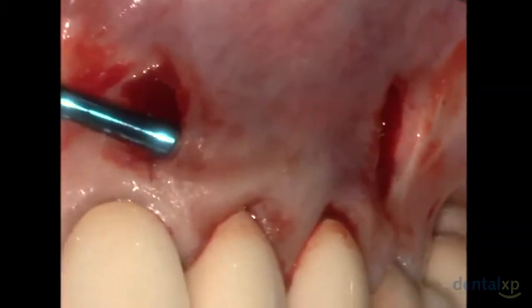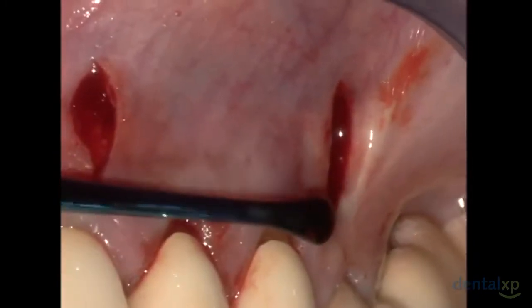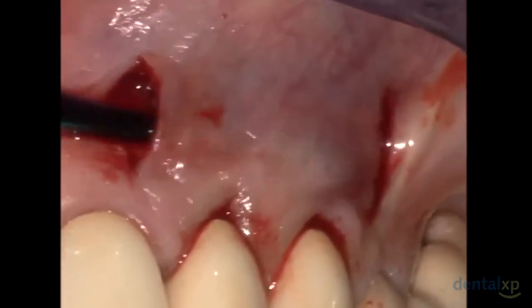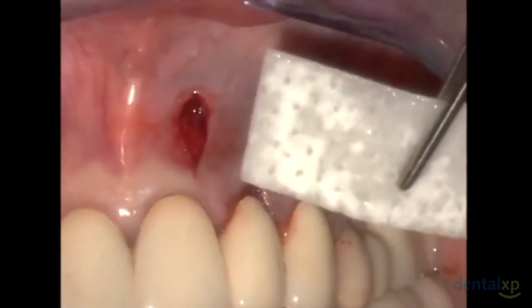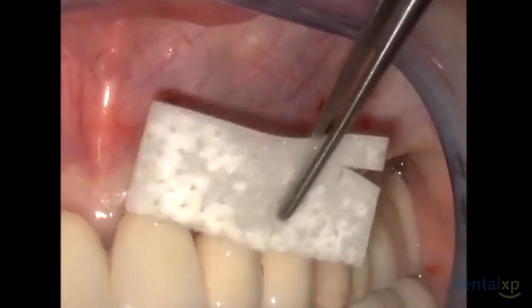We extended it into the interproximal areas, and we're now testing to make sure that we've relieved the flap enough to be able to apply tension-free closure once the grafts have been positioned. And you can see how that instrument, the VISTA elevator, is now being extended all the way through from the mesial to the distal vertical incision.